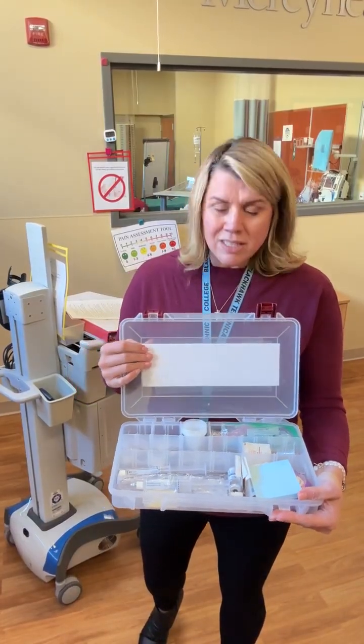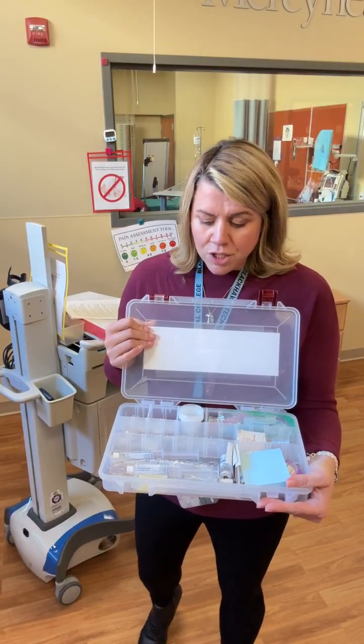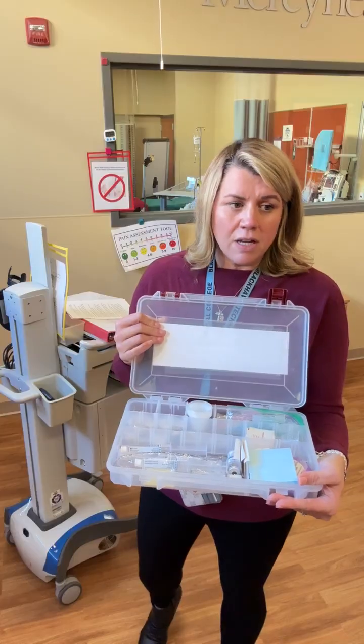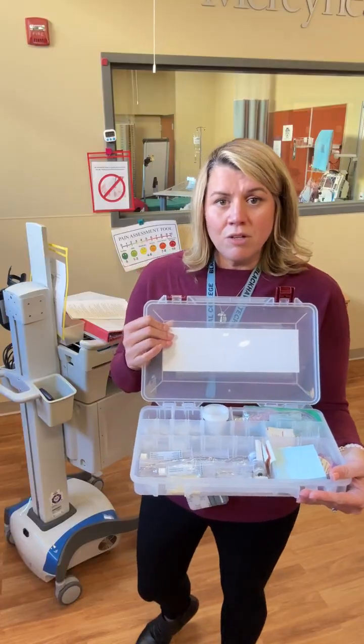And then there's always going to be extra stuff too, because when you're getting into a Pyxis or some sort of system with medications, it's not typically just one area for one patient. You're pulling meds that are specific through the entire Pyxis system. So make sure you're looking through this and getting what you need.